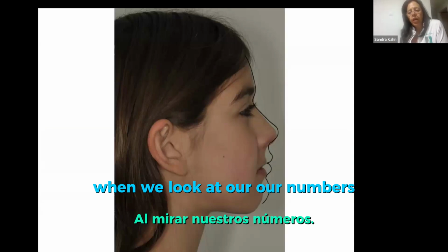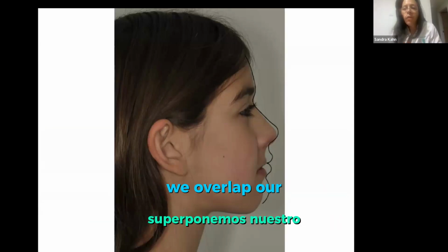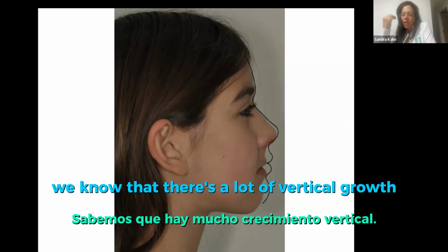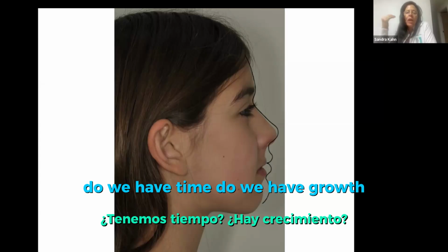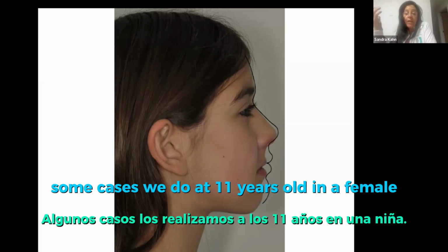When we look at our numbers, we look at our indicator lines, we overlap our Bolton template over the face, we know that there's a lot of vertical growth. And whatever we do in this patient is definitely going to worsen the case. Do we have time? Do we have growth? Do we have potential to make it better? Some cases we do.